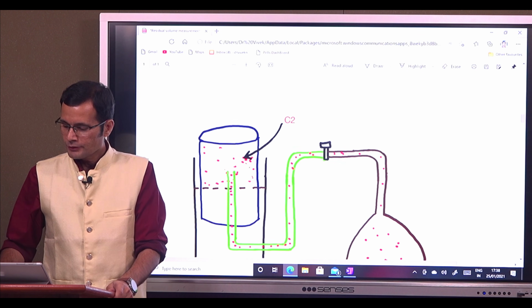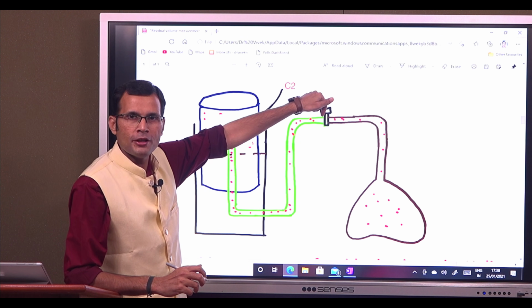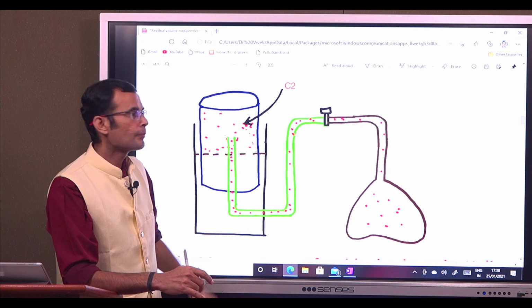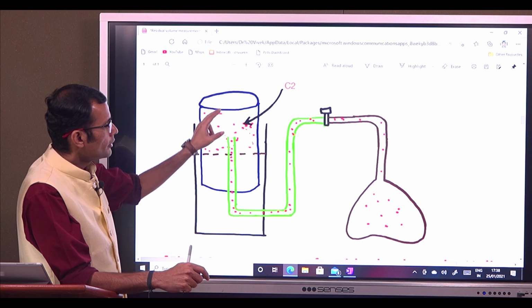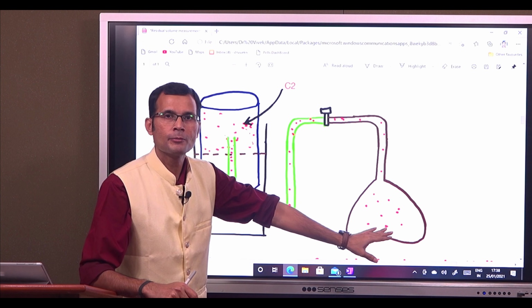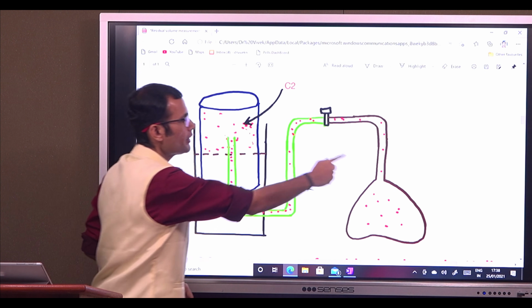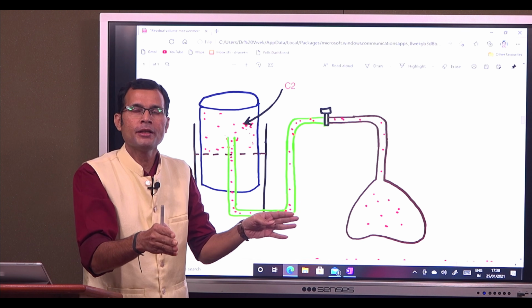In fact, the next diagram will illustrate this. The valve was opened, the subject starts breathing, and at that very moment the helium from the spirometer goes through this tubing, through the respiratory passage, and into the lung. But what you should have noted is that now the spirometer and the lung have become one system or one compartment.